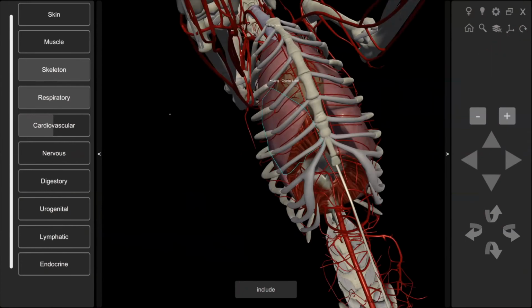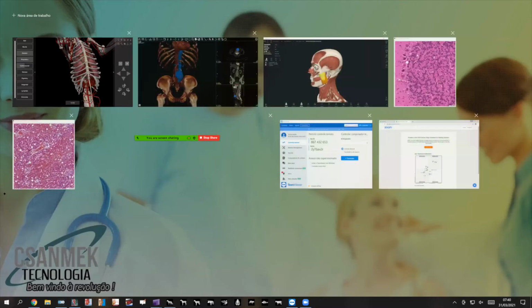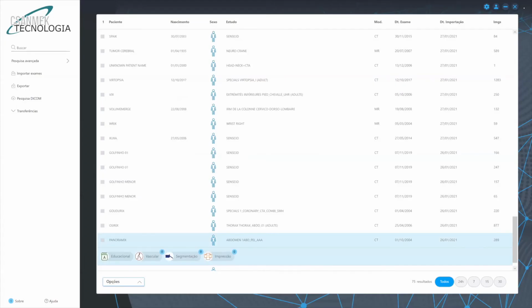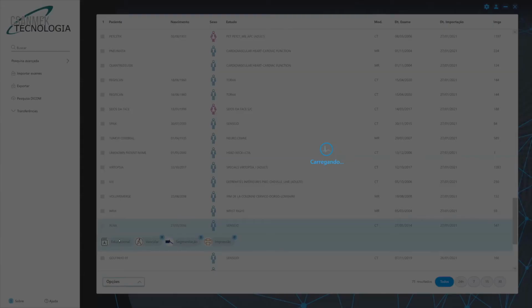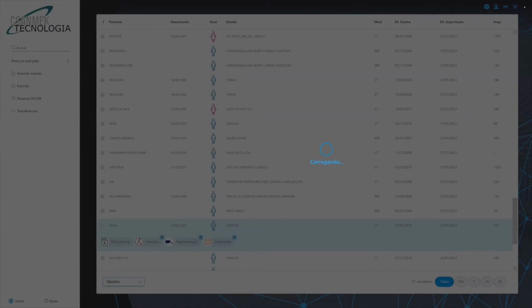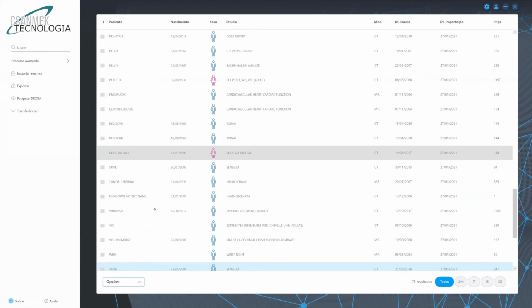Just to finalize our demonstration of the 3D platform so far, we want to show a reconstruction we can do. This is an aneurysm from a patient. Pode mostrar a reconstrução, Cláudio. We will. Não, pode ser do humano mesmo. So we'll open a human anatomy. That's a very nice solution we have, which allows you to reconstruct and rebuild just the system you wish.